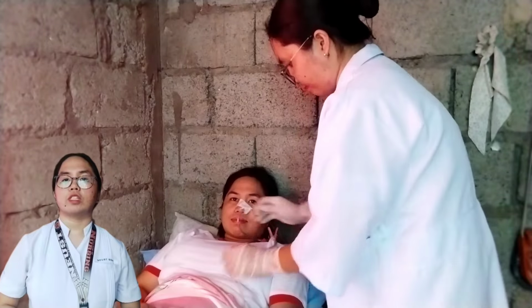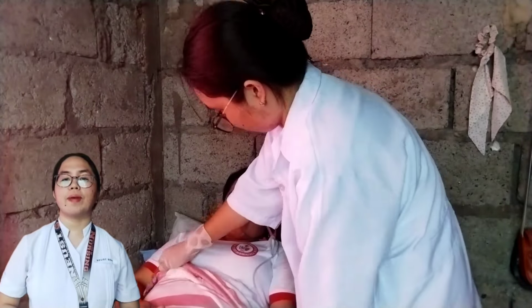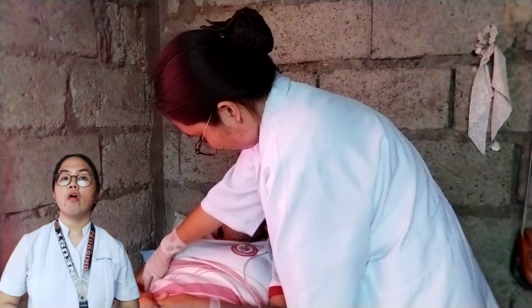Ask the client to remain sitting upright in Fowler's position or in a slightly elevated right lateral position for at least 30 minutes. Rationale, these positions facilitate digestion and movement of the feeding from the stomach along the alimentary tract and prevent the potential aspiration of the feeding into the lungs. Ma'am, just stay in that position for 30 minutes, okay?